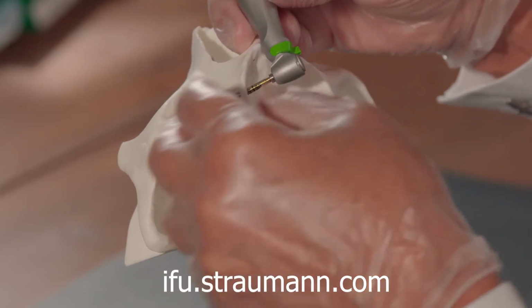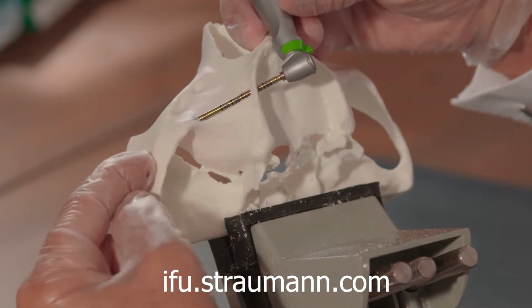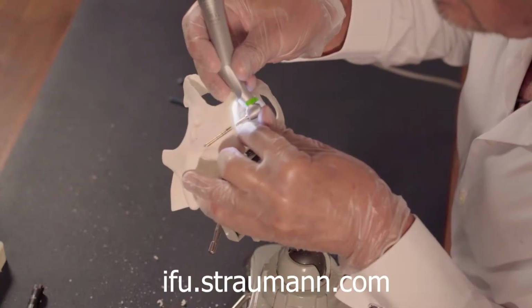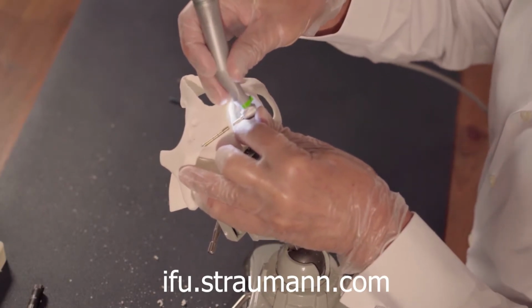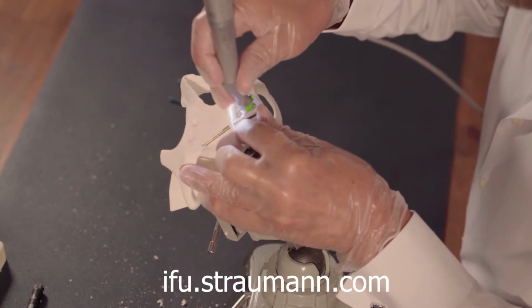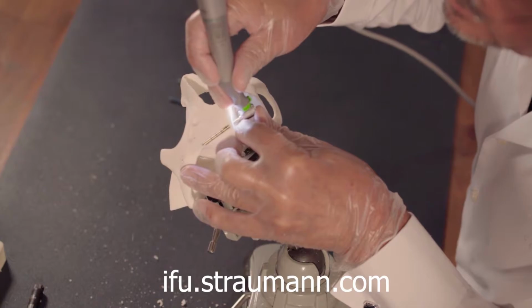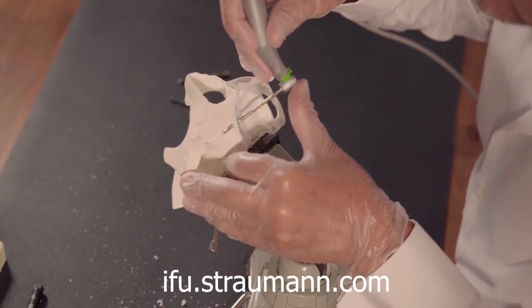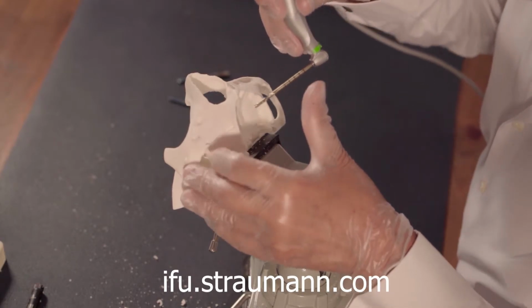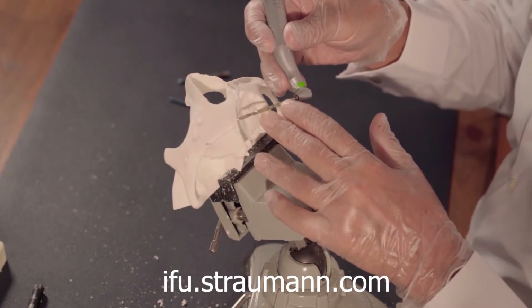You see, now this is a critical moment. We see the chips getting out on the other side. So now we have to control our force in order not to damage the skin. Okay, we are on the other side. Pay attention to the direction when getting out also, in order not to destroy this amount of bone.